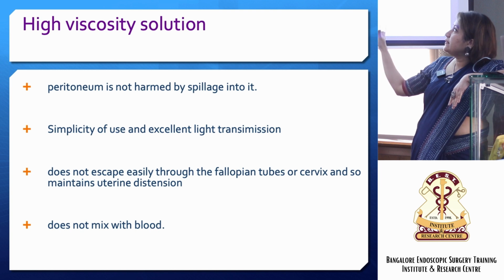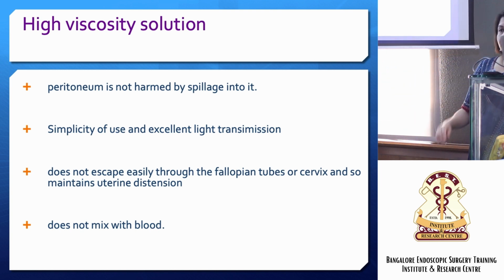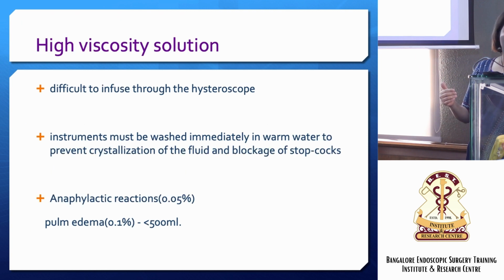So again, this becomes very theoretical, just for the sake of knowledge that you need to know that these are the different media: the gas, the low viscosity and the high viscosity.